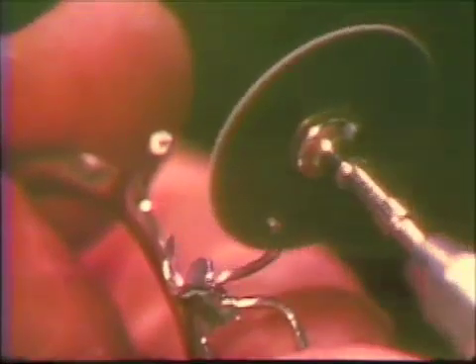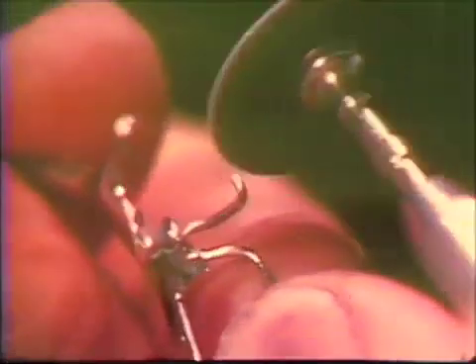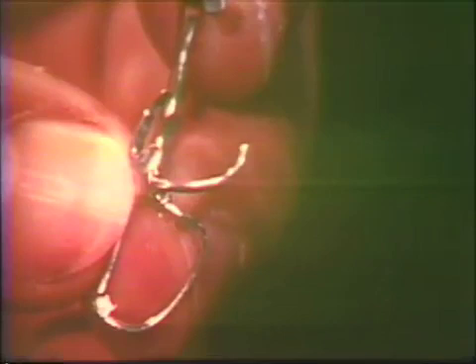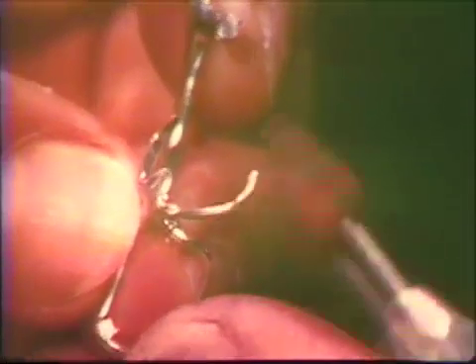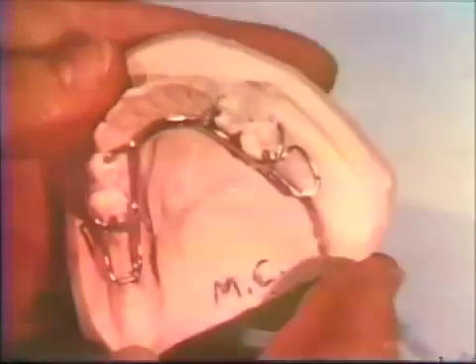Ideally, the retentive clasp will be so formed and adapted to the tooth surface that when the framework is in the rest position, the clasp terminal would be in a static relationship with the abutment tooth. A fine textured disc is used to remove any residual plier marks and to round, taper, and polish the clasp terminals. Rubber abrasive points are used to complete this procedure. The contouring and adaptation of the wrought portion of the combination clasp complete the pre-delivery of the casting.